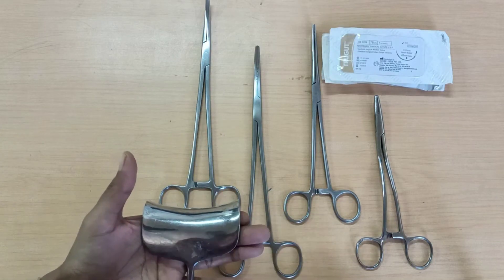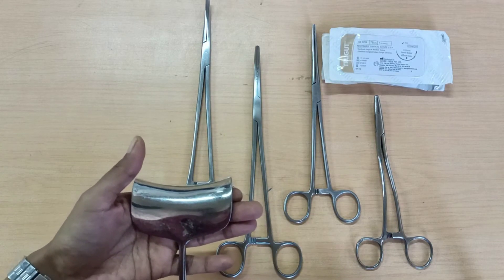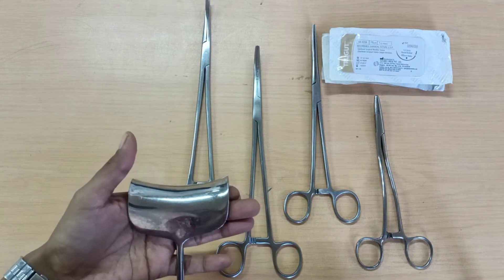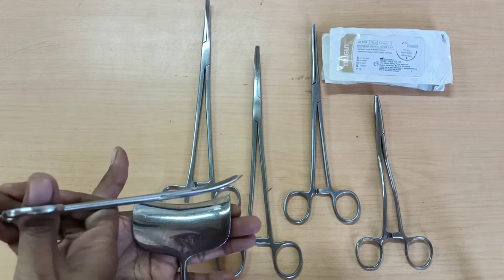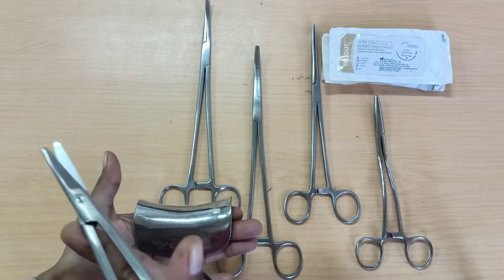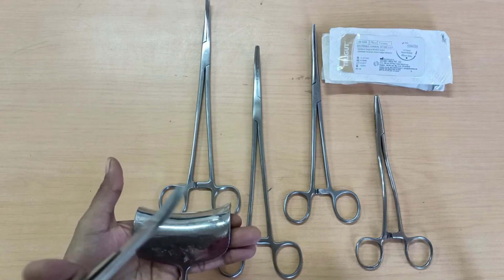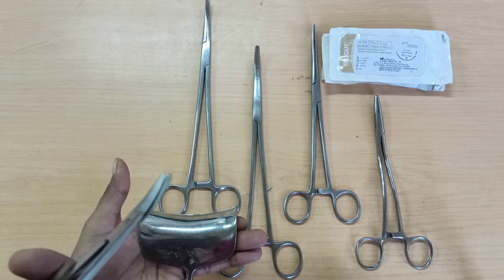To extend the incision you can use a blunt method or a sharp method. For the sharp method you will require scissors, and this is how you are going to make the incision over your uterus.